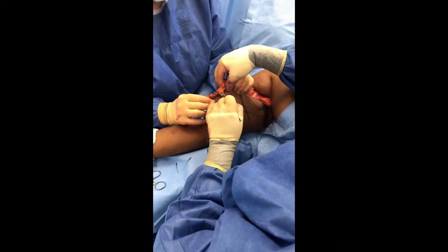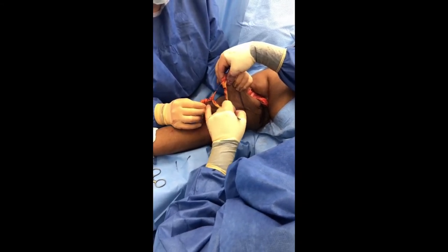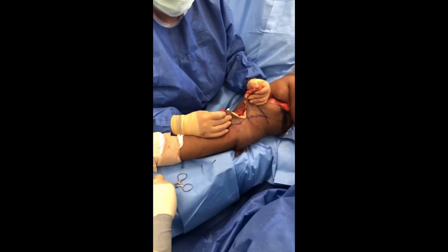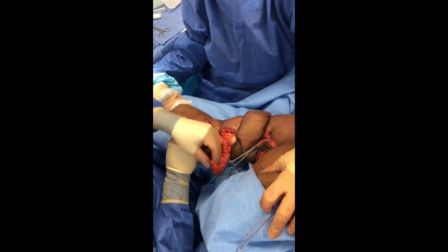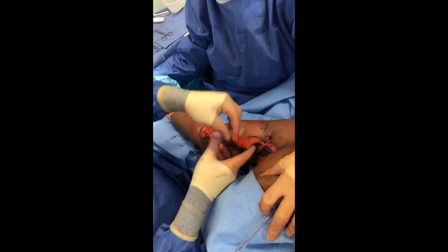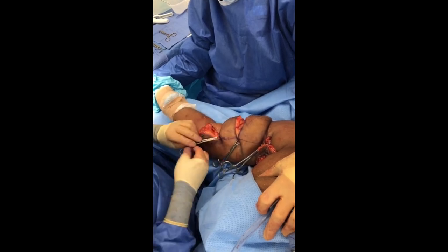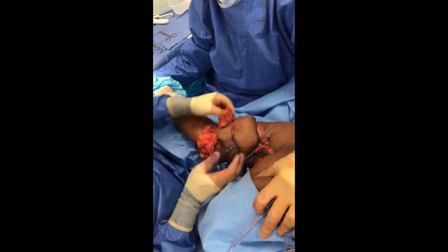In order to be able to close this, we're going to do the bisecting technique — come down to our line and then bring this closed like that. We've done our trisection here; we have three pieces, and you can see this is the length of tissue we're going to remove. Her arm has been clamped together so it's much smaller in caliber.